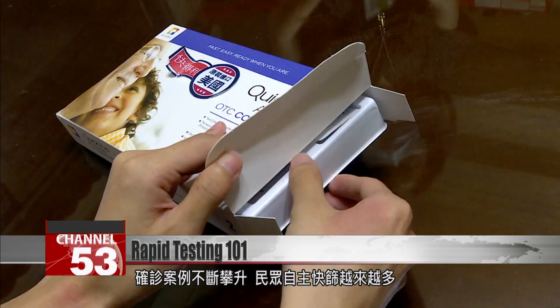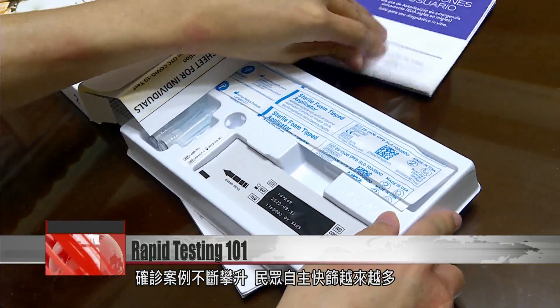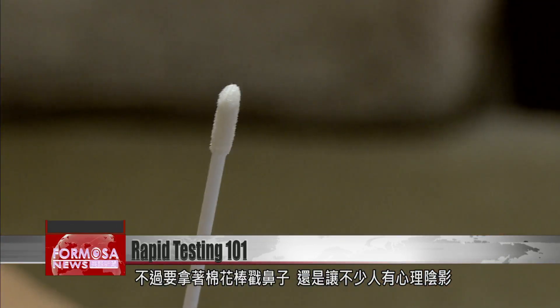As local COVID cases continue to rise, more and more people are trying out at-home rapid test kits. But sticking a cotton swab up one's nose can be a little intimidating.